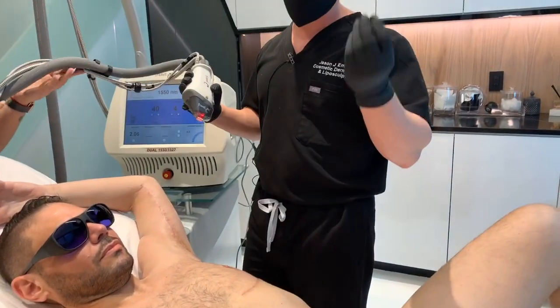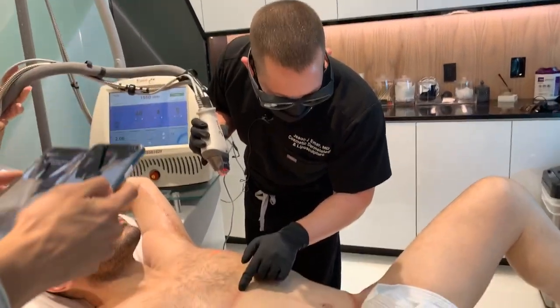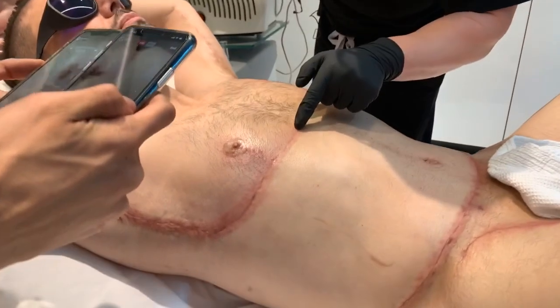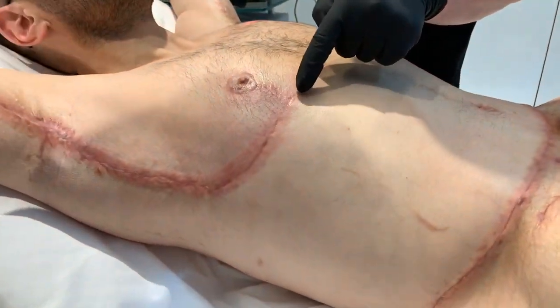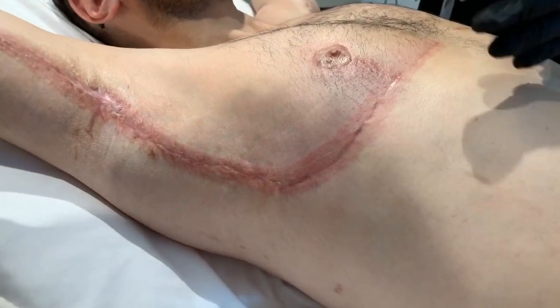The VBeam works to decrease the thickness and redness. And the Fraxel, if you look really, really close, forms little teeny dots of heat inside the scars that over the course of the next 3 to 5 days will lightly speckle, peel, and remodel.